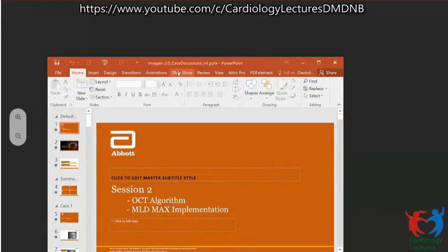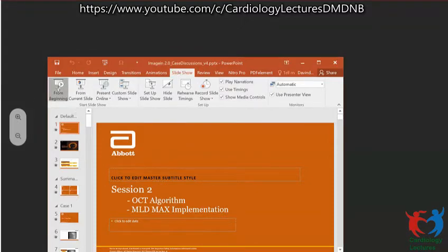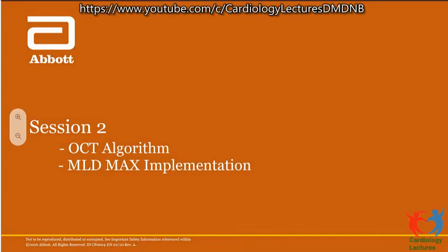Sir, I want to ask, in a concertina effect, is there any role for sizing of vessels with the OCT? Vivek, if you have a concertina, your image quality is going to be poor. Everything is going to be a problem. A vessel which has got constricted and is tortuous, your assessment is going to be fallacious. So this is a very difficult situation.